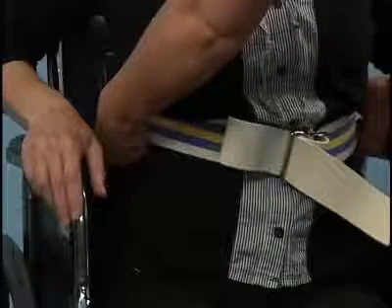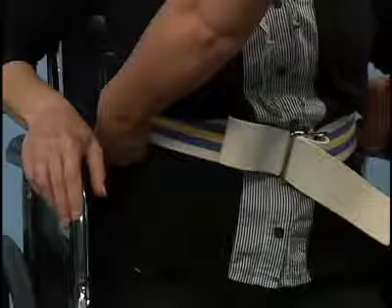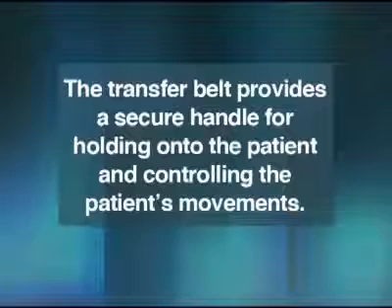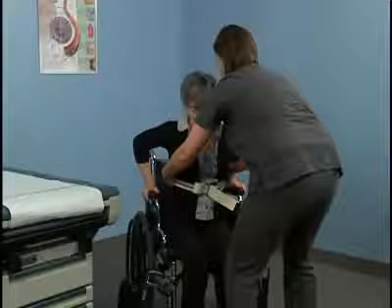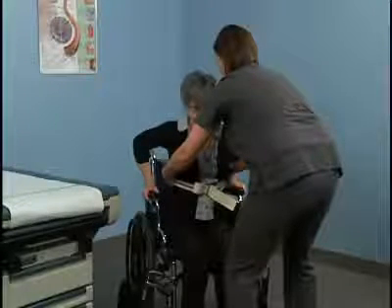Ask the patient to place her arms on the armrests of the wheelchair and to lean forward. Grasp the transfer belt on each side of the patient's waist using an underhand grasp. The transfer belt provides a secure handle for holding onto the patient and controlling the patient's movements. Tighten your abdominal and gluteal muscles in preparation for the transfer. Instruct the patient to push off the armrests and into a standing position on the count of 3.